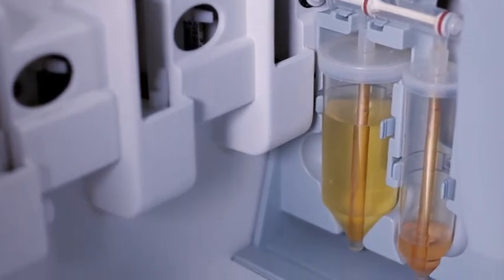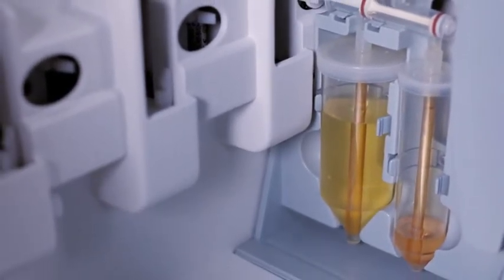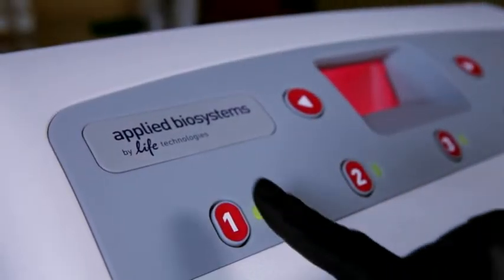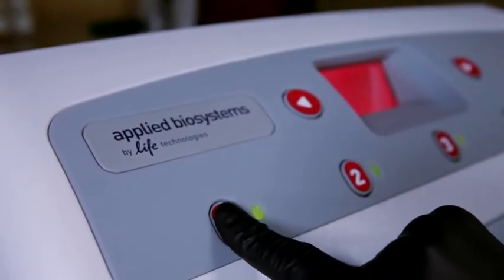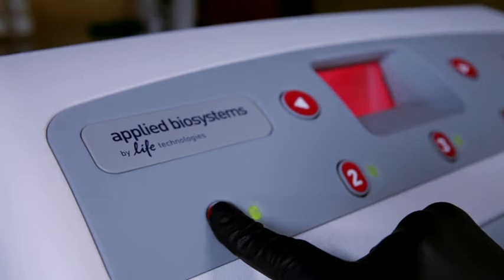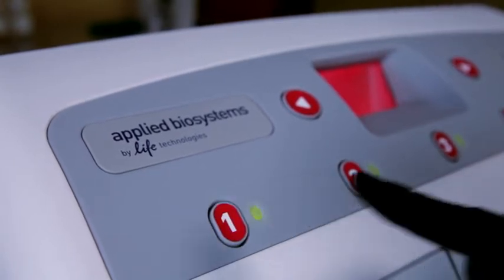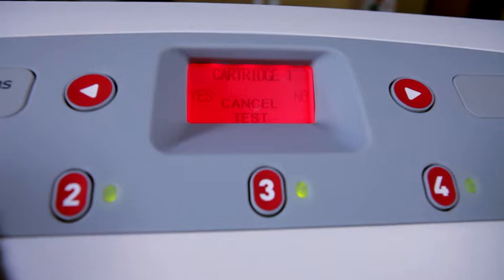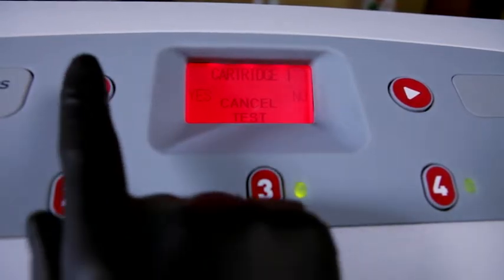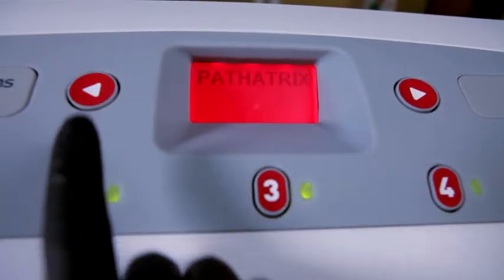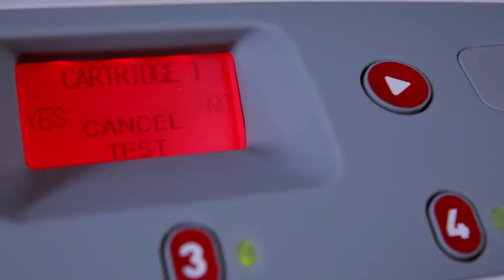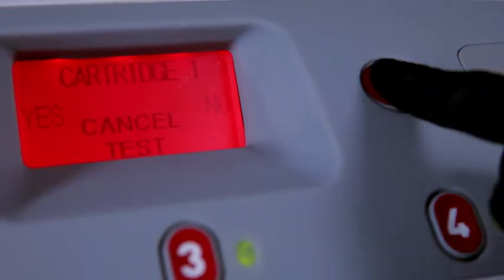When the capture cycle is done, the wash cycle will start automatically. If you need to stop the capture cycle to add beads or an elution buffer, press and hold the number button for that cartridge for five seconds. The display will ask if you want to cancel. Press the left arrow for yes, which will stop the run and let you add beads or buffer. Or push the right arrow for no, and the run will continue.